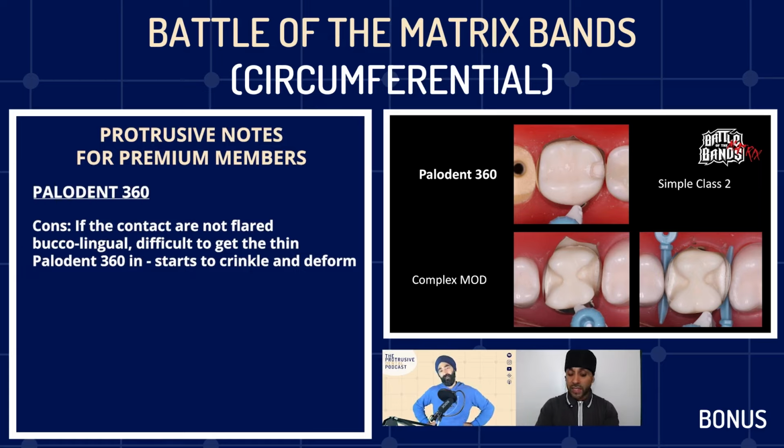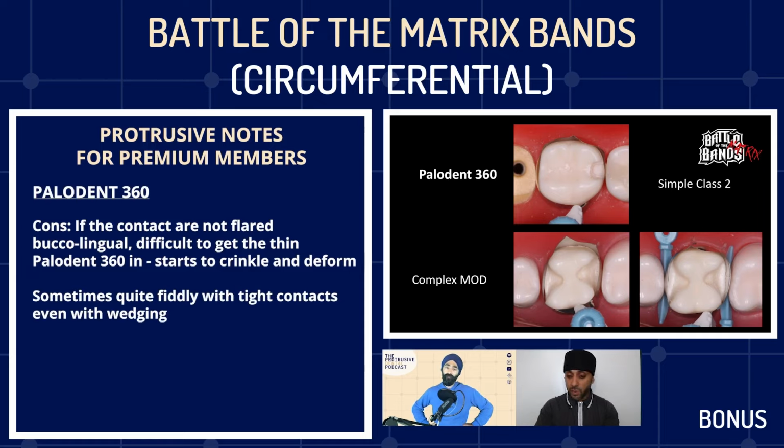So then that's another cost, right? If you keep doing that two or three times, you can imagine the cost adds up in that regard as well. But it can be frustrating. Somebody will say to you, well, why don't you just flare the margins outwards, which you can do, and that would be the solution. But just a note that it was quite fiddly whenever the contacts were quite tight.